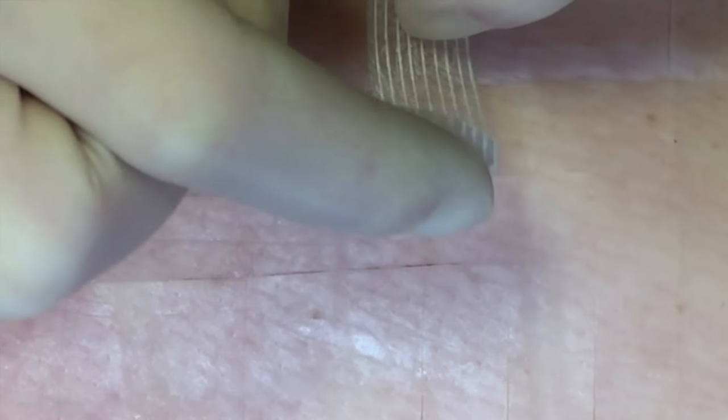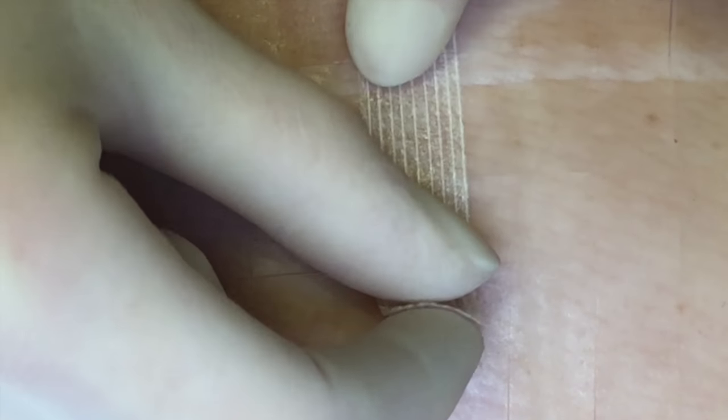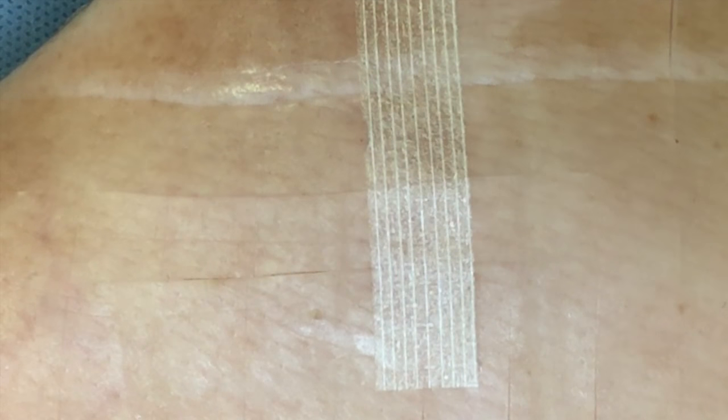Remember that once you have removed the suture, the wound is relatively weak. You can help support the wound to reduce the risk of gaping, opening or dehiscence by using SteriStrips. To apply SteriStrips, you lay them perpendicular to the wound edges as shown here.